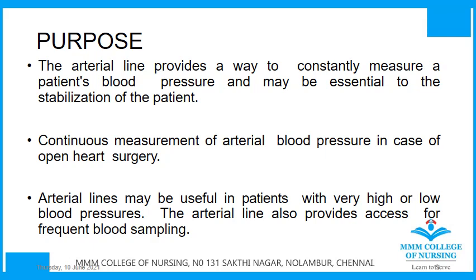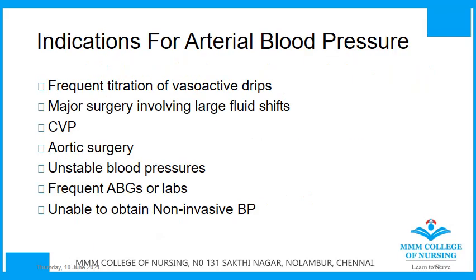Then the arterial line also provides access for frequent blood sampling. Whenever you want to withdraw blood, you can also use this. So this is the purpose of the arterial line. Moving on to the indications. The indication comprises of frequent titration of vasoactive drips.